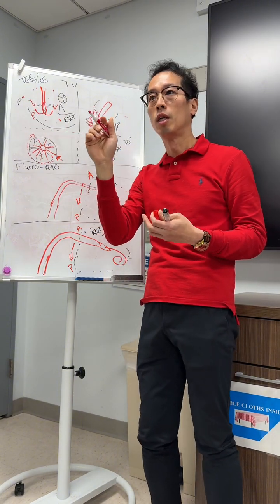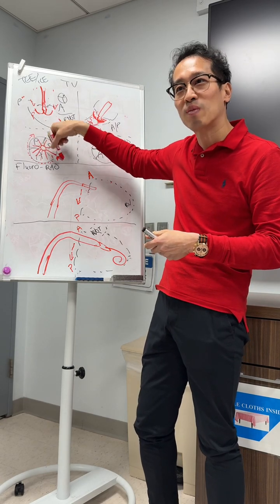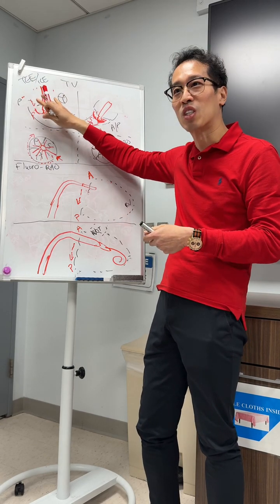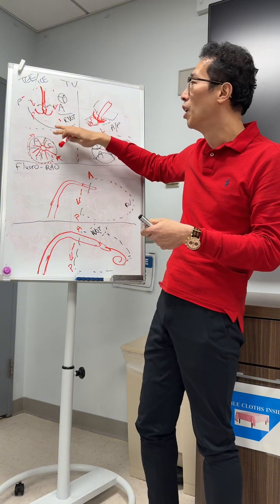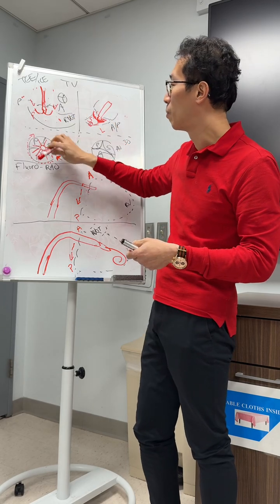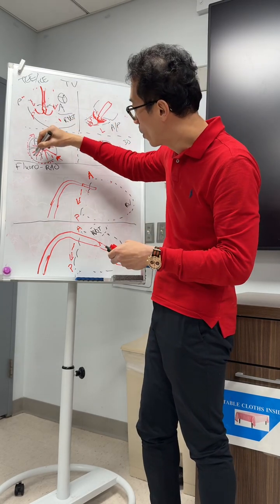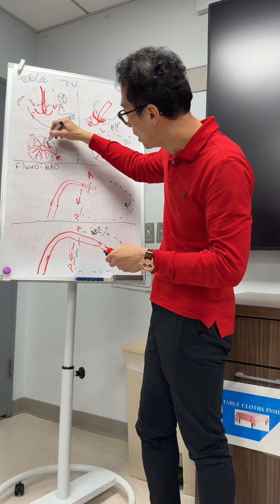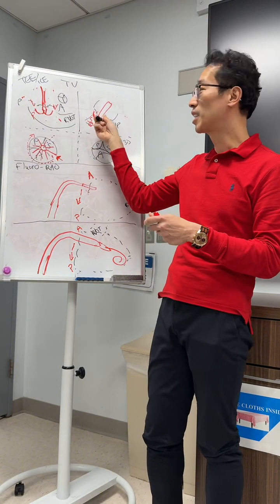So don't forget. Now remember also, sometimes when you're so focused on this part while spinning, you actually drift the image offside. So you just ask your imager to recalibrate and recenter, so you might be able to see both sides. Okay? And remember when you do this, what happened? You have 90 degrees, right? You have a crosshair, right? That's this side.